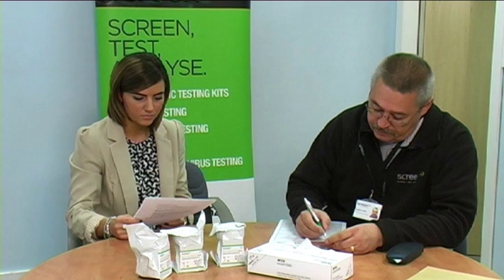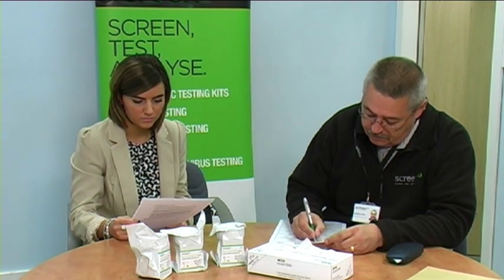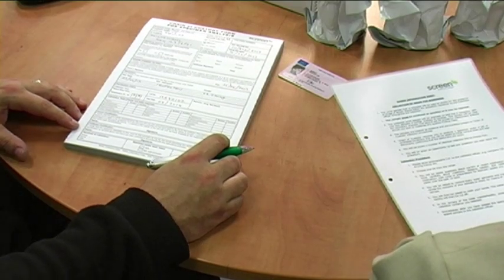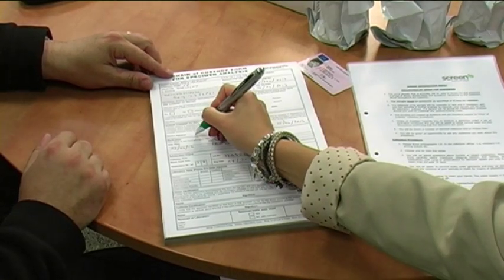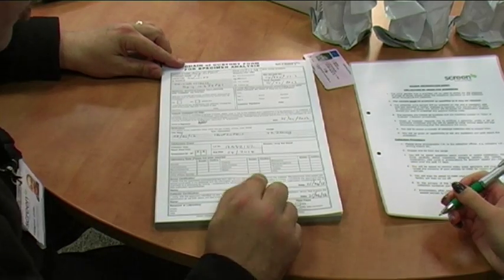The donor will be given an information sheet to read, detailing the full testing procedure from start to finish. The collection technician will invite questions regarding the procedure from the donor, and then take the donor's details and record them on a multi-part form. The donor will be asked for their written consent to carry out the test. This will be recorded against signature. Once consent has been gained in writing, the test may begin.